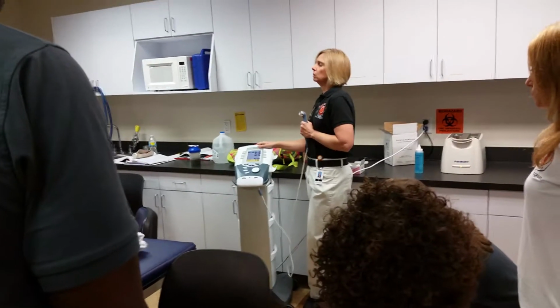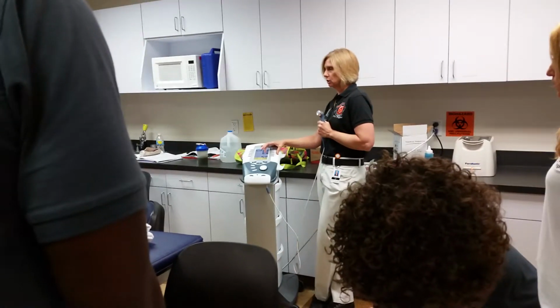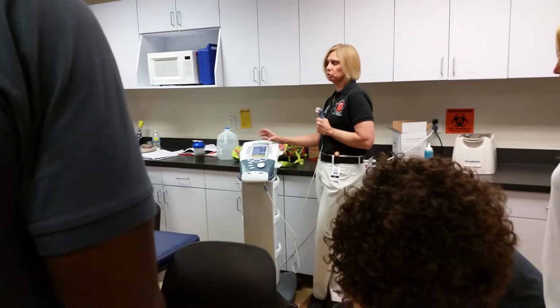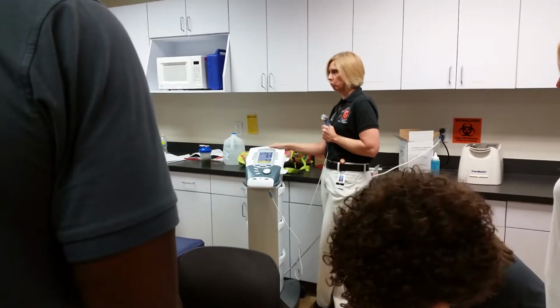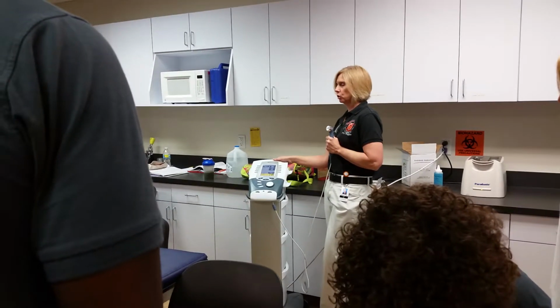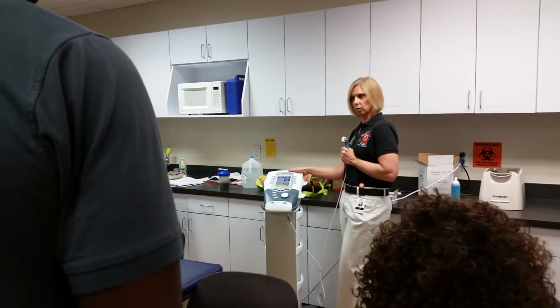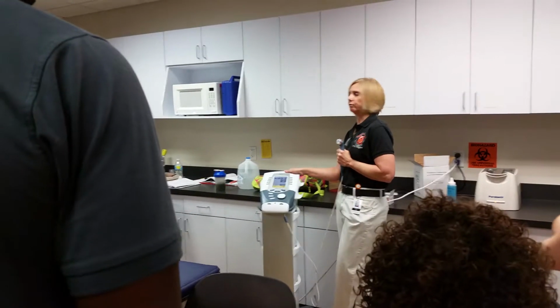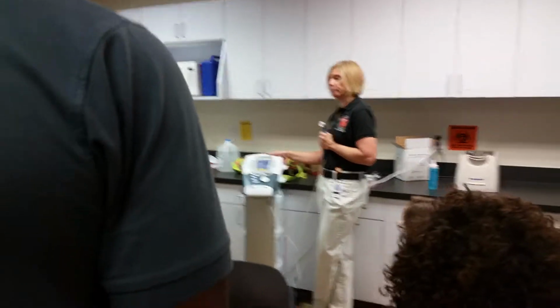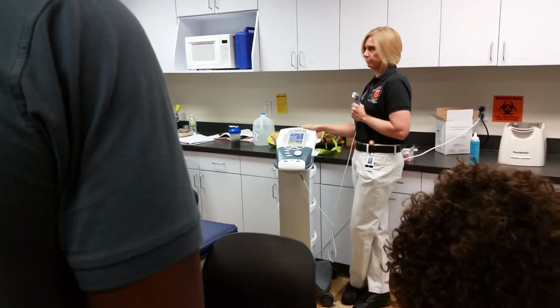If you're doing a superficial area and you're doing a continuous setting, you generally don't have to turn the intensity up very much to get that mild heating. Usually it's going to be somewhere between 0.5 and 1 watts per centimeter squared because it's very superficial, so it doesn't take much. So if you're getting up to 3 watts per centimeter squared, something's wrong, okay? And they're not feeling it. Maybe the unit isn't actually turned on and you're increasing it, the number's increasing and they're not feeling anything, but you need to stop and pause it until you figure out what's happening, okay?